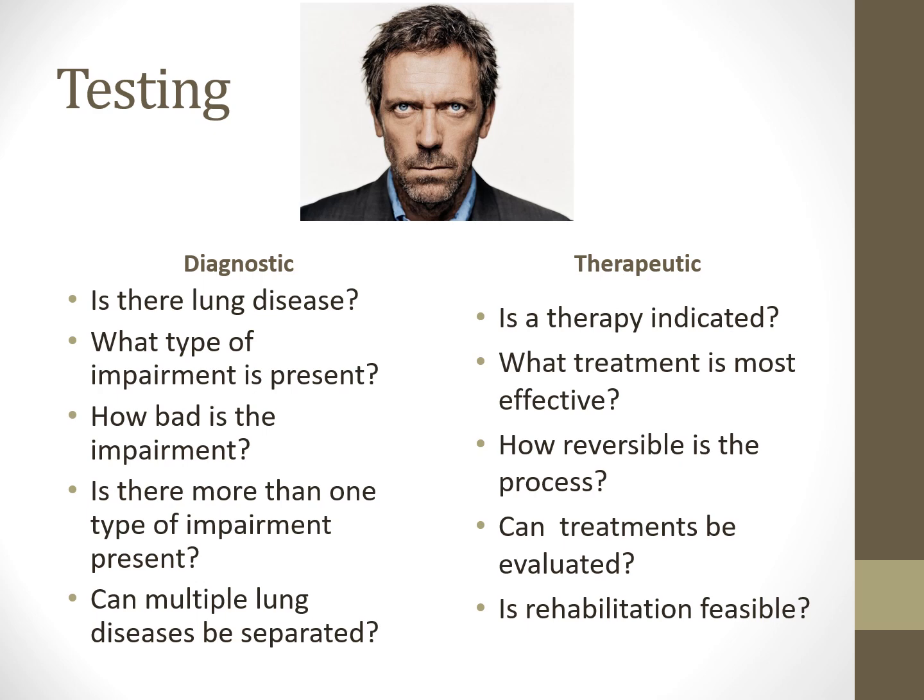So what are some indications for diagnostics? When we're looking at diagnostics, is there a lung disease, right? Someone gets short of breath and they don't know why. Well, they can come in and do a diagnostic test. Is there a lung disease? Compared to getting a chest x-ray or something like that, I can see really quickly, by having them blow into the machine, if there's a lung disease present or not, right? That we can detect there.